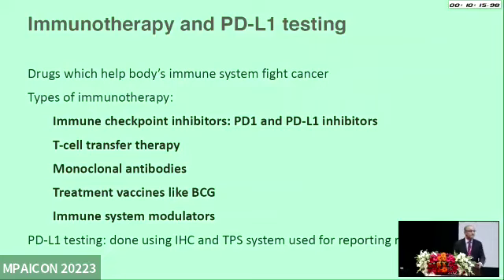Immunotherapy has become very important in the last decade, and specifically PD-L1 testing. Somebody showed a case of melanoma that was, I think, one of the first cases treated with immunotherapy, and that patient responded very well, and then relapsed after a few months. We test for PD-L1 very routinely in our setting for lung carcinoma specimens.